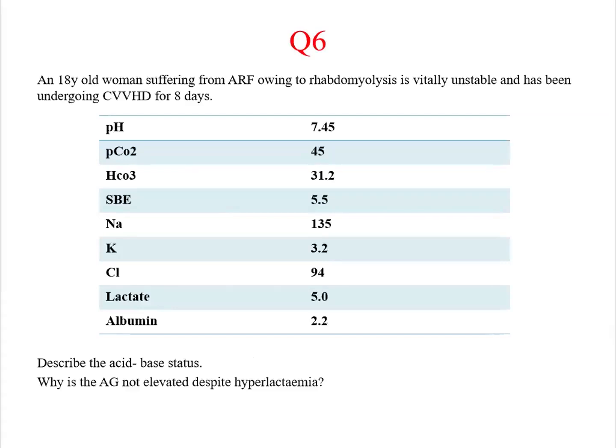Now here the pH is 7.45, PCO2 is 45, bicarbonate is 31, sodium 135, potassium 3.2, chloride 94. The lactate is 5, albumin is 2.2.